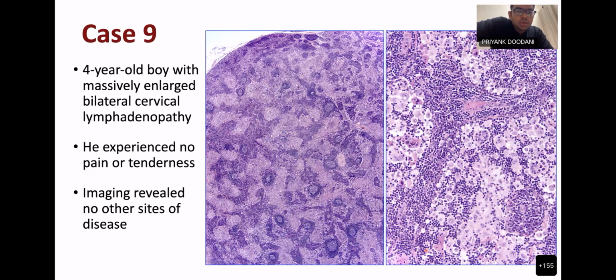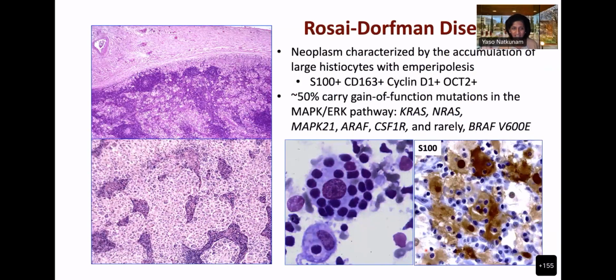Excellent, thank you both. So here are more pictures. And emperipolesis is what you were describing so well. And S100 is the traditional marker. Now we have many others that can also do a good job.